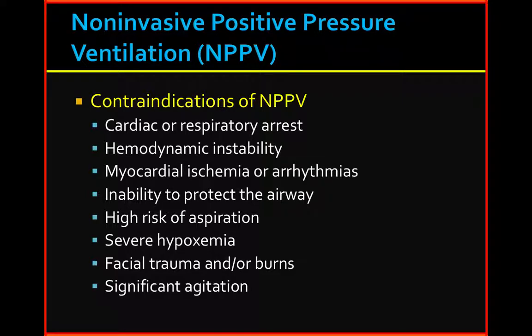And then the other number you set is how many breaths per minute you want this machine to go off. As he said, if he sets it at 12, then 60 seconds in a minute divided by 12, you know every 5 seconds that device is going to be going off. So those are basically the numbers that you're setting for this. This works great also if the patient is 100% sedated. So they're coming out of the OR, they're not breathing at all on their own, maybe they're too sedated, and the machine will do all the work.